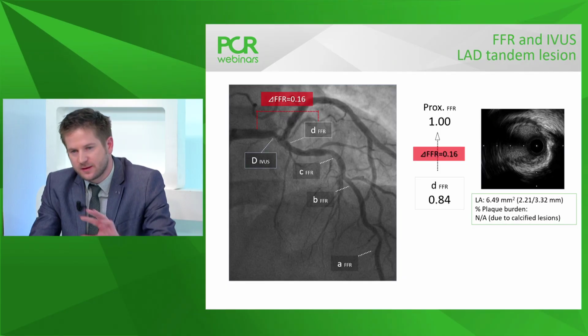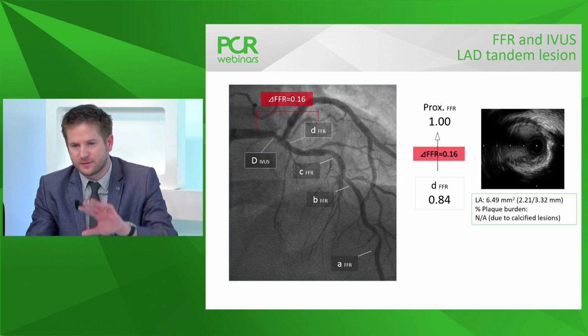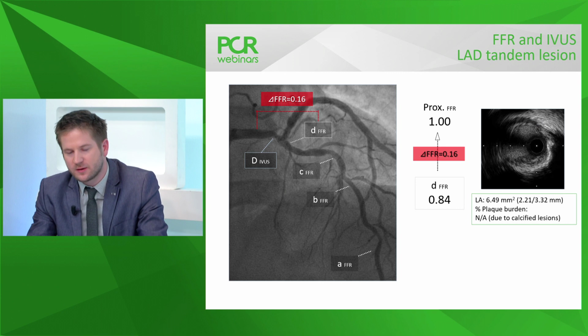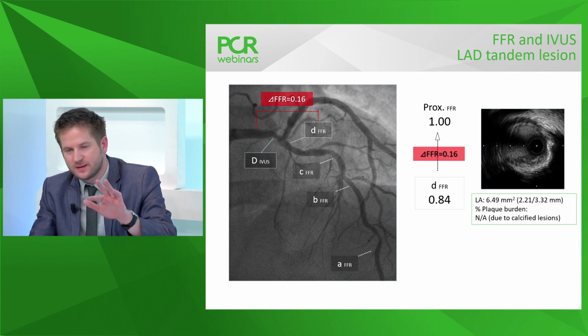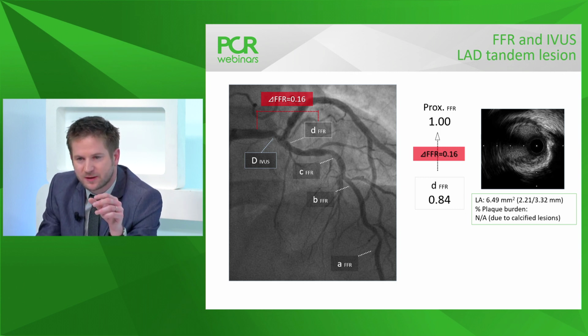And now, Gabor, can you comment on the FFR pullback, please? Yes, so this pullback demonstrates very nicely the different step-ups all over the different lesions, and you have shown very nicely that the mid-LAD lesions cause only minor pressure gradients, and the biggest pressure drop is located actually in the left main.